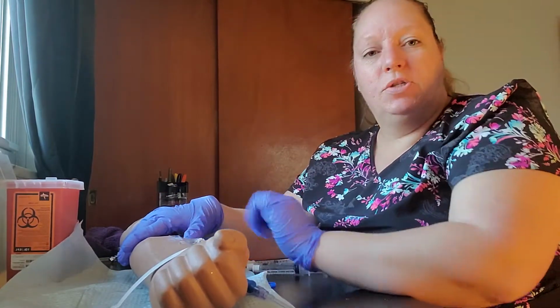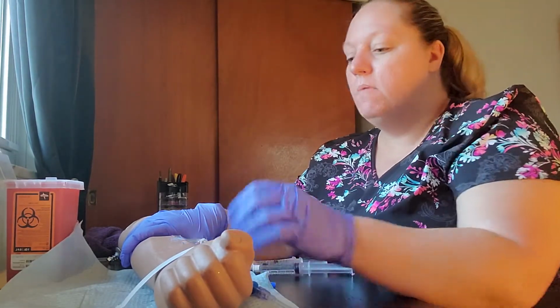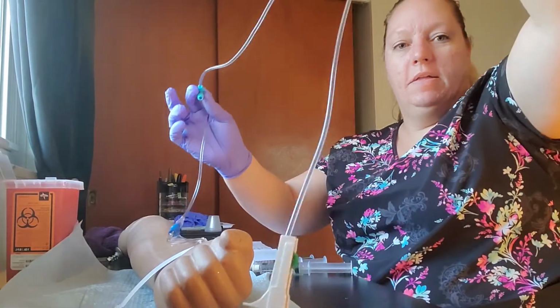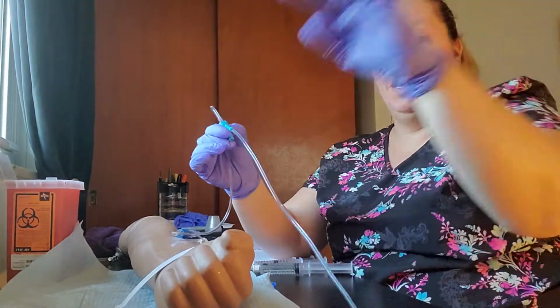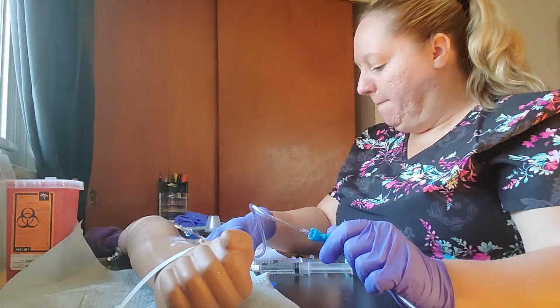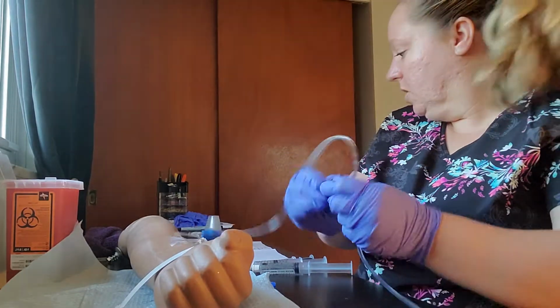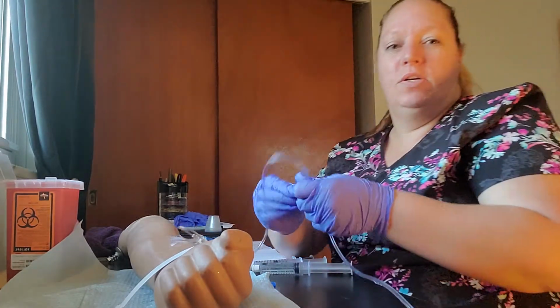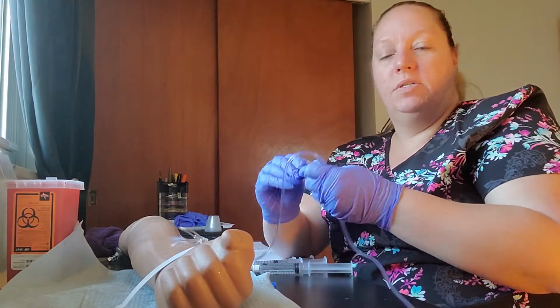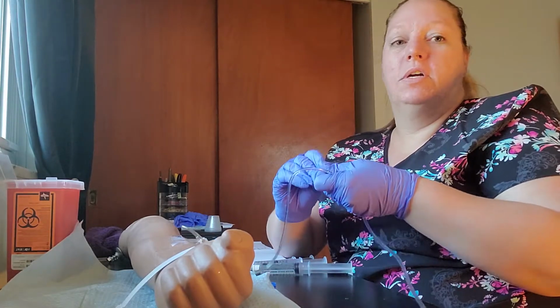You always want to check and make sure if there's any coolness or any paleness to go along with this as well. We want to make sure that our IV fluids are running, and they are. Mine is just behind the camera. I will then clean my port. Again, it just depends on your policies and procedures with your institution or your hospital on how long you're going to clean this port.